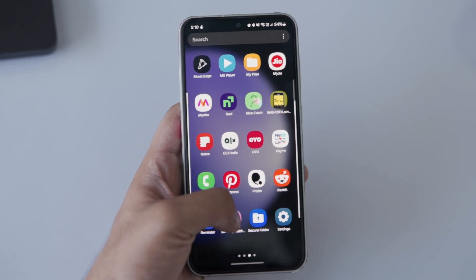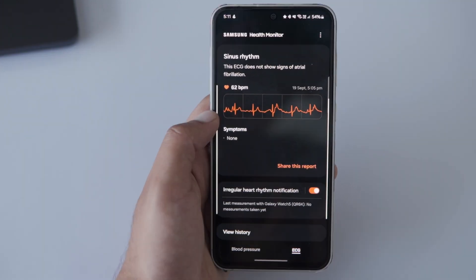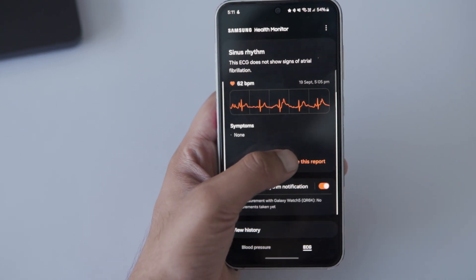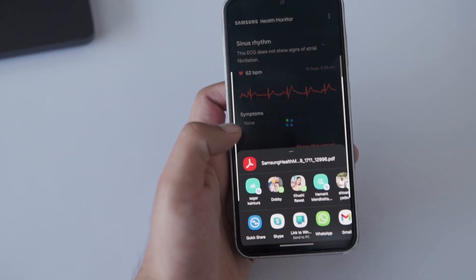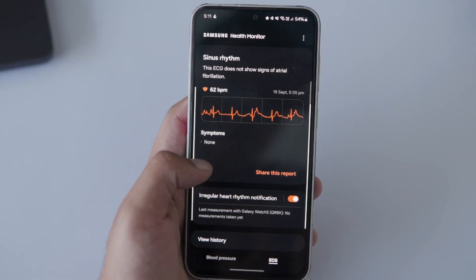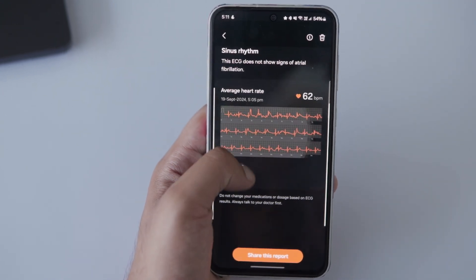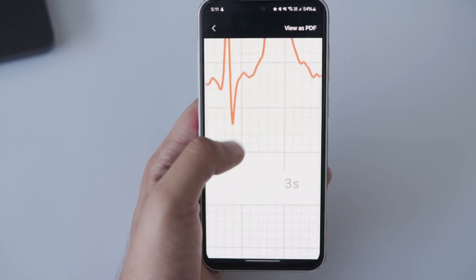Once you have measured your ECG, your results will automatically be converted into a PDF. Open the Samsung Health Monitor app and tap on the ECG option. Here's the result we got during the test. Below this, you'll see the Share this report option — just tap that. Now, select the ECG report you want to share. From here, you can choose any method you prefer: email, Google Drive or any other service. Your ECG report will be sent wherever it needs to go.